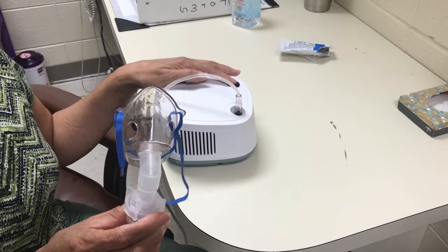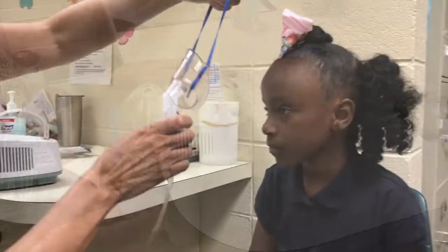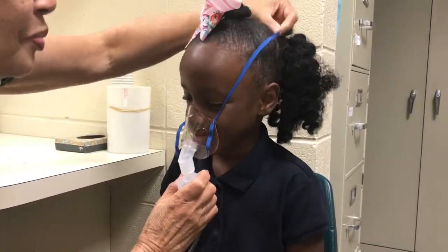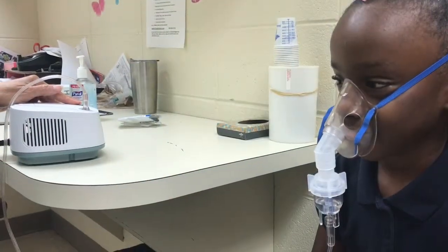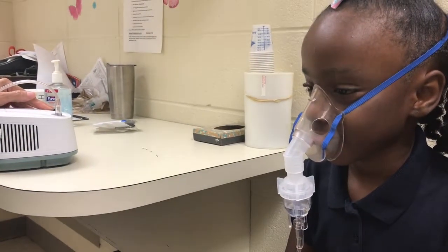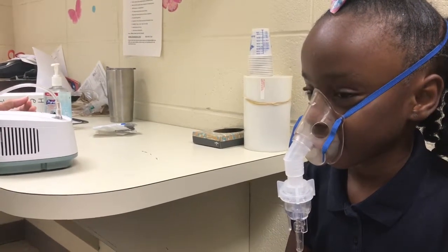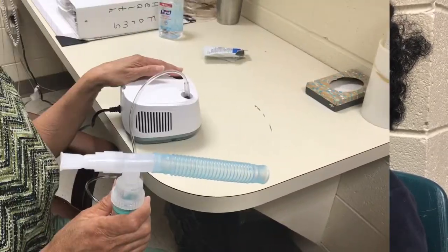Now it is time to begin the albuterol nebulizer treatment. For the small child, apply the mask to the face by securing it with the attached elastic band. Encourage the child to breathe slowly and deeply to get as much medication into the lungs as possible. Albuterol normally works quickly to open the airways to get oxygen into the lungs. At this point, parents and/or EMS should be en route to pick up the child.